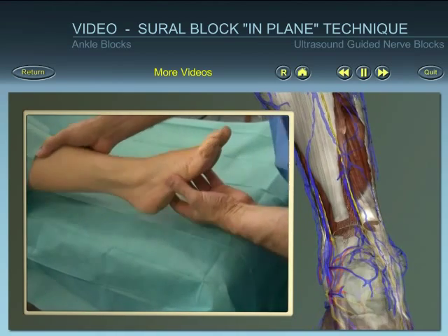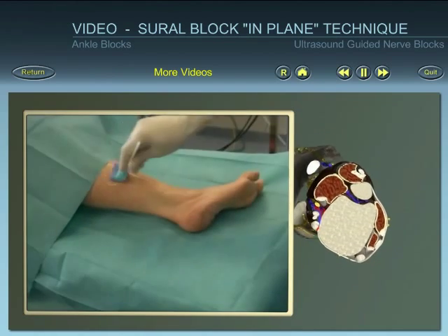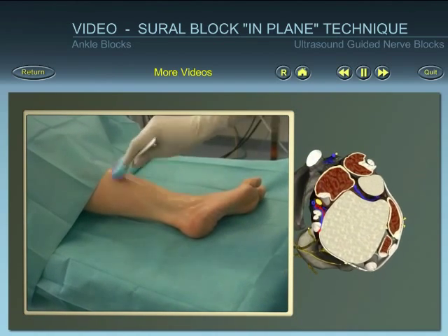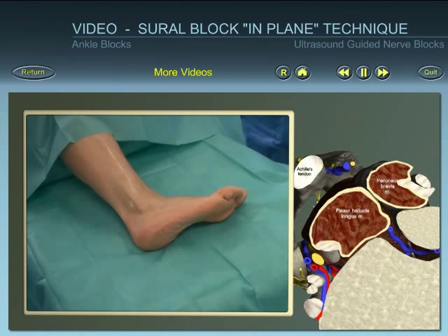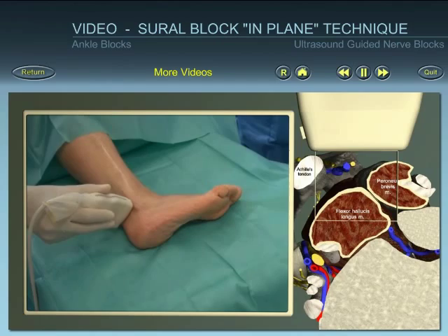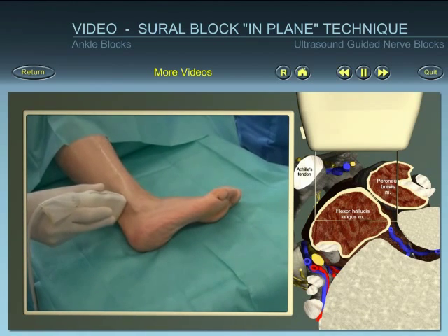Position the patient and identify superficial landmarks. After skin disinfection and using an aseptic technique, place the ultrasound probe. Align, rotate, and tilt the probe to obtain the best view of the sural nerve.